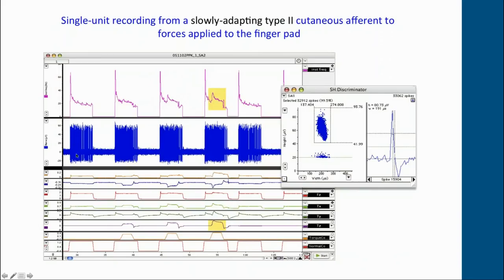Using the NeuroAmpX we can get very crisp recordings from single myelinated axons. This is a slowly-adapting type 2 ending — a Ruffini ending in the finger pad — where we're applying a compressive force and superimposing a rotational or torque force. This shows a screenshot from the window discriminated Spike Histogram software, where we can put windows around a cluster of spikes. The Windows version has much better functionality than the Mac version, including template matching, which is very useful, allowing you to remove or insert spikes directly — very powerful software.